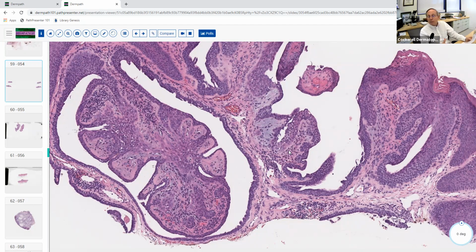Maybe associated with nevus sebaceous. Well, hopefully you know that that's one of the most common adnexal neoplasms associated with nevus sebaceous. That and trichoblastoma. Those are the two most common adnexal lesions that we see in nevus sebaceous. So yes, may be present at birth or developed during childhood. Well, yes, this is a birth defect. It's a hamartoma. So yes, it's going to develop near birth.